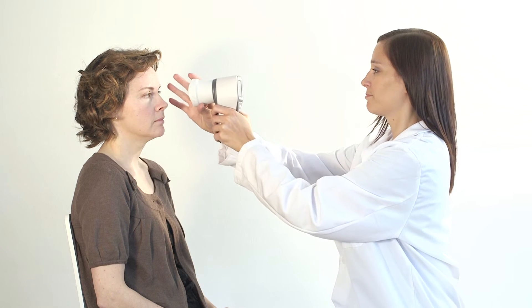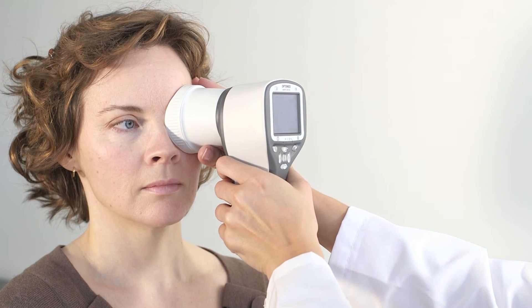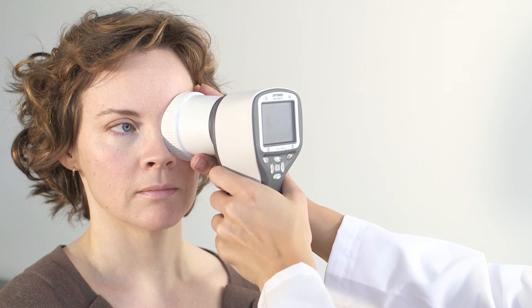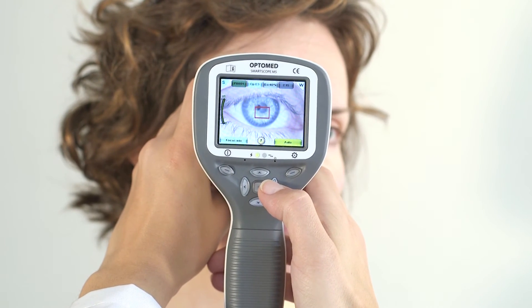Hold the camera with one hand and support the optics module with the other, keeping the hand against the patient's forehead. Place the optics module cup on the patient's eye. Depending on the patient's facial bone structure, use different angles to find the optimal viewing position. Adjust illumination by using the left and right arrow keys.